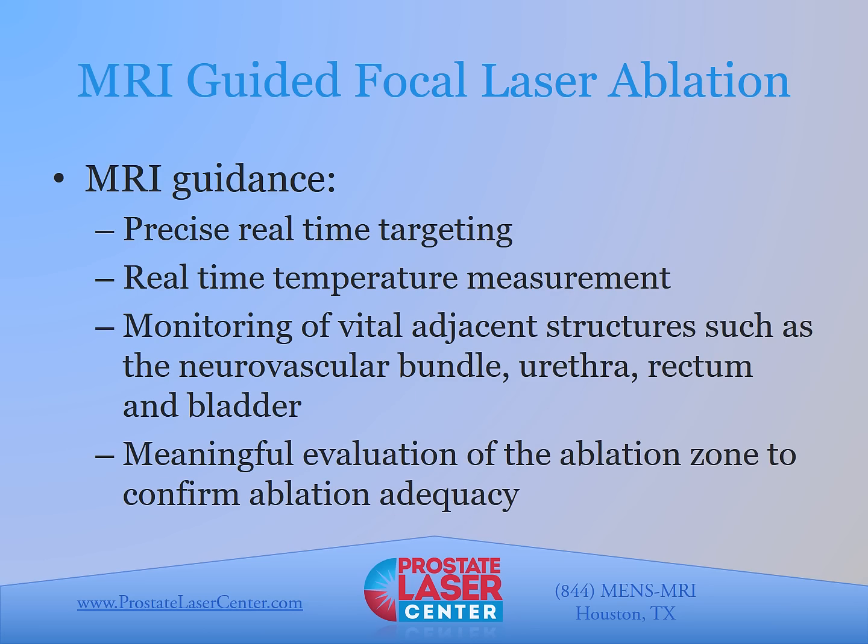Now, in contrast to HIFU, where the vast majority of practitioners are using ultrasound or fusion guidance, MRI in-bore guidance has many important advantages. It allows precise real-time targeting of the lesion itself. You can see the lesion. It's amazing. It allows you to measure temperature changes in the prostate as you're turning on the laser fiber, which then allows much better control of the laser energy, adjustments of the laser energy, and the location of the laser, which then allows much more precise application of that heat. You can make a much more precise zone of ablation using MRI guidance than without it.